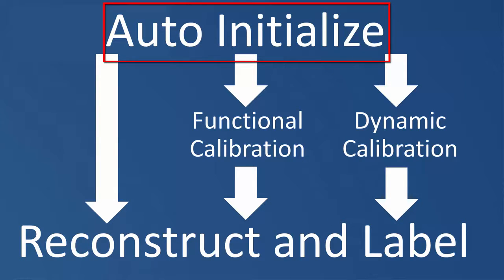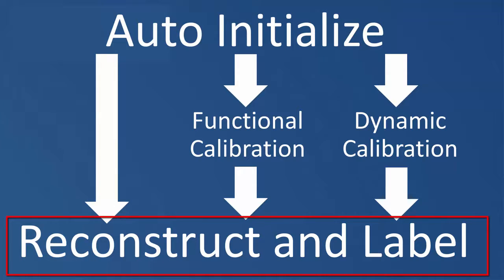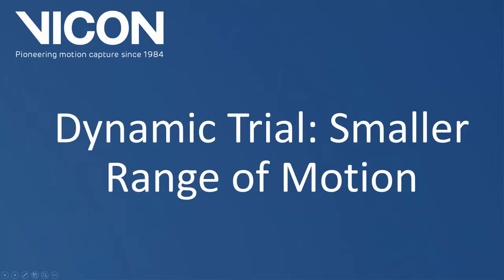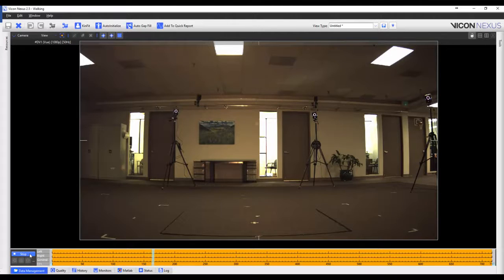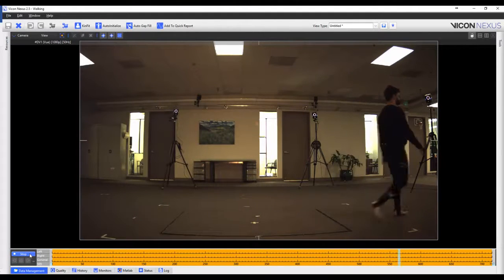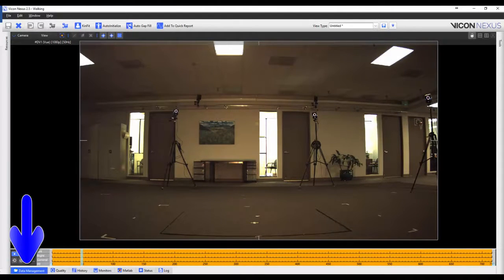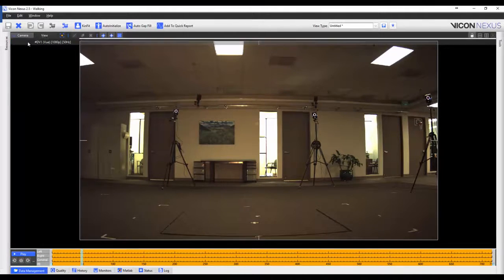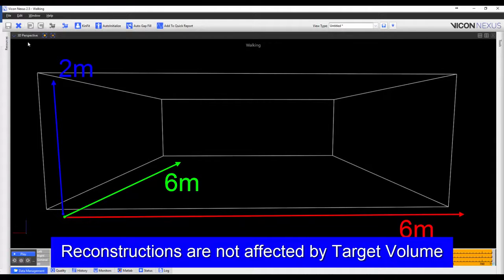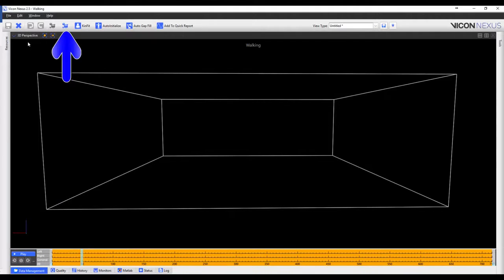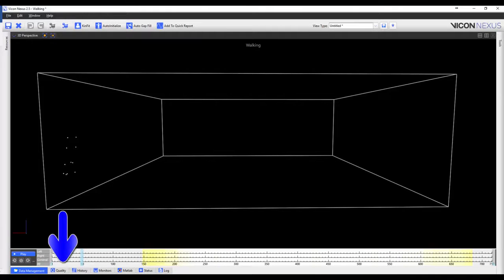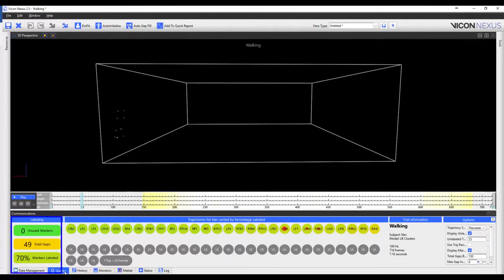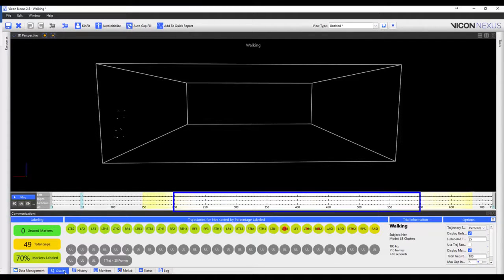I'm now going to use the static calibration that we performed in the previous step to reconstruct and label a dynamic trial with a small range of motion. I have captured a trial where my subject is walking across the volume. I've already loaded the trial from my data management. When I change to the 3D perspective view, you can see that I have created a 6 by 6 by 2 meter cube to show the target volume. When I run the reconstruct and label pipeline and check the quality tab, we can see that we have 49 gaps and 70% of the markers are labeled. We can see in the heat map and when we play through the trial that the subject only enters the capture volume after approximately frame 200 and leaves the volume again around frame 600.